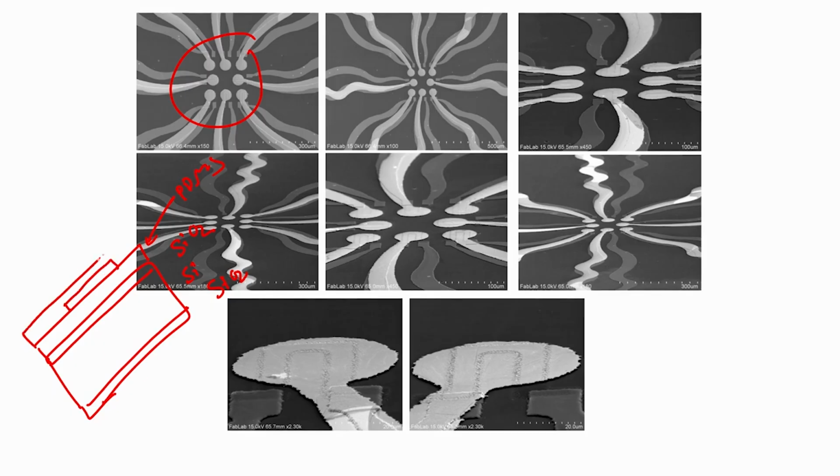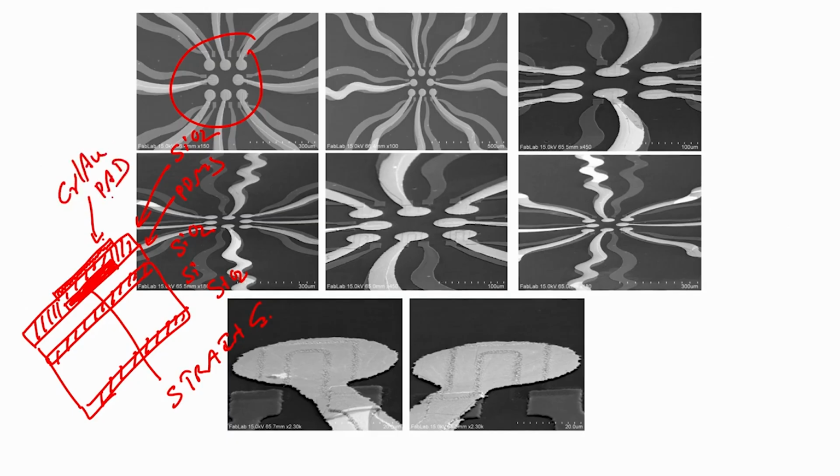On this strain gauge we have insulating material, which is our SiO2, and on this strain gauge I will have the chrome gold pad, which you can see here, correct.